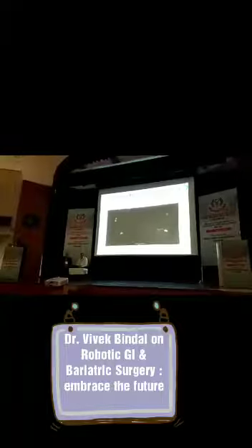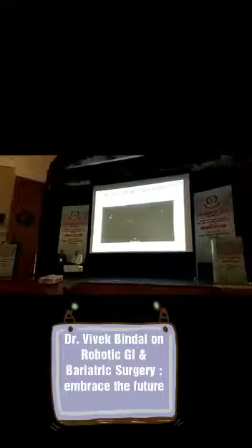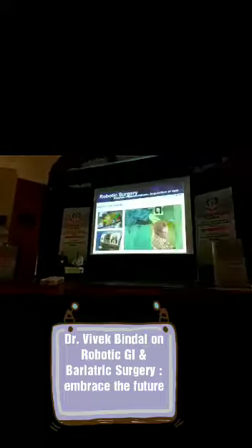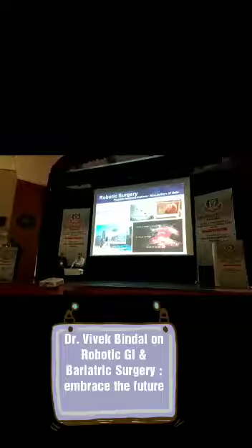Here you can define the course of splenic artery, which is something very difficult in tumors to identify. Sometimes the pancreatic tumors would engulf it. So it lights up green. So this is ICG fluorescence, which is lighting the splenic artery, and then the spleen will light up. So you can easily see where your major vessels are. These are the future applications.